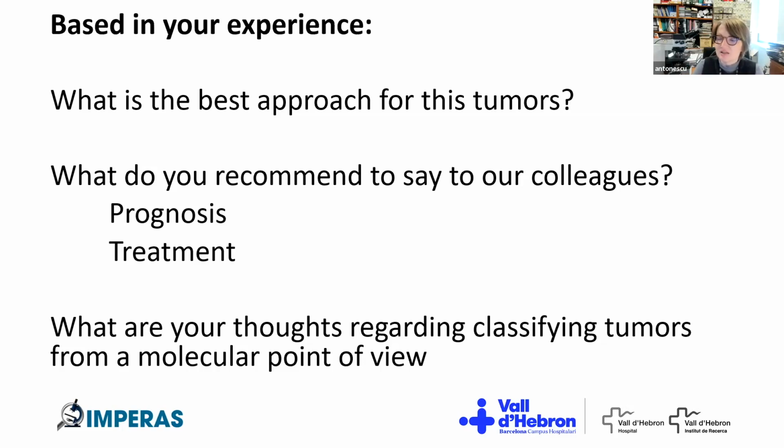So let's start with your question about this being an epithelioid mesothelioma in a relatively young adult, with EWS ATF1 fusion. In our series, most, if not all, cases that we included there were classic mesotheliomas with papillary features. This one does not look like exactly your classic mesothelioma.